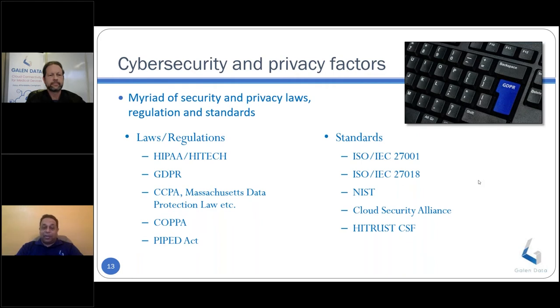And then one that I think is gaining the most traction in healthcare is what we call HITRUST. It's again an alliance, nonprofit, I believe, but it's an industry alliance that comes up with a set of security requirements. They call them CSF, Common Security Framework. And that essentially is a set of requirements that you can apply and get certified against. So those are considerations you need to make if you're selling. A lot of hospitals now require you to have HITRUST. They require your infrastructure to be 27001 compliant. So a lot of those things become business requirements going forward.